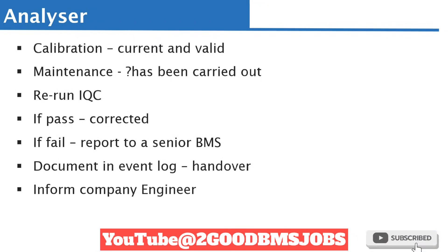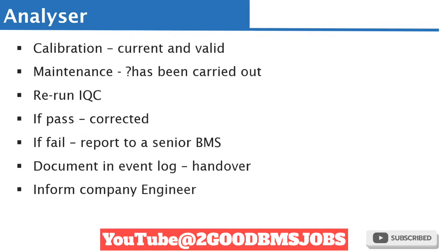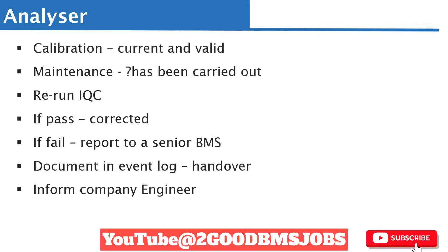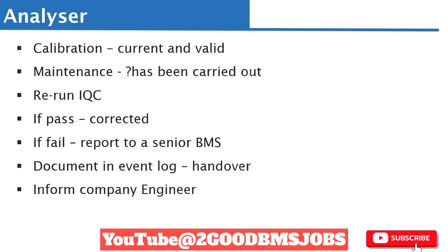If you have done all you could and were not able to solve the problem — if you reran the internal quality control and it continued to fail — then once you have reported it to a senior and documented it in the event log, the next thing is to inform the company engineers and ask them to come and look at the analyzer. Before the engineer arrives, it is advisable to put a sign saying the analyzer is temporarily out of use, or isolate it so someone else will not use it.